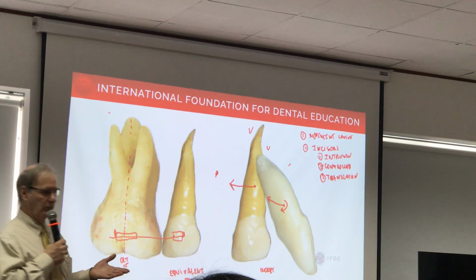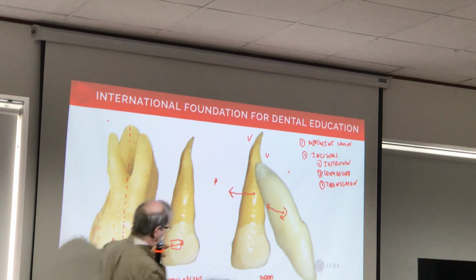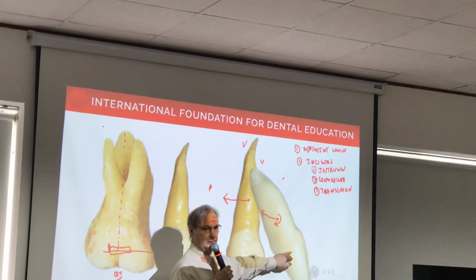Everybody has a clue? The first thing is number one. You're going to put some wires here, okay, and intrude these teeth.